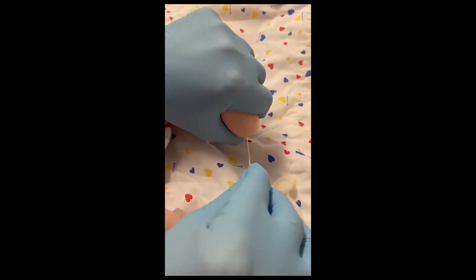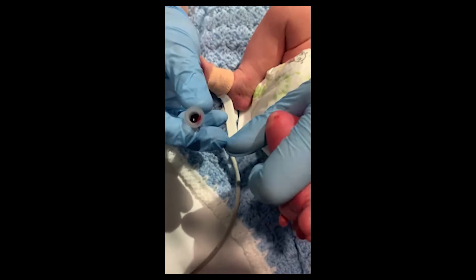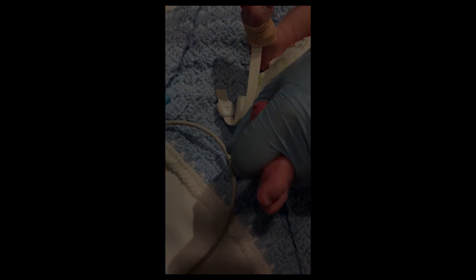Small air bubbles in capillary tubes can be removed by occluding one end of the capillary tube with a gloved finger and tilting the tube at a 45-degree angle. This promotes the air bubble to travel towards the opposite end of the tube where it can be expelled without the loss of the patient's blood sample. The same heel prick technique can also be used to collect larger samples of blood. A thin layer of vaseline can be applied to the skin to promote larger blood droplet formation; however, I would not recommend this if you're taking a blood gas sample as this can damage the equipment.